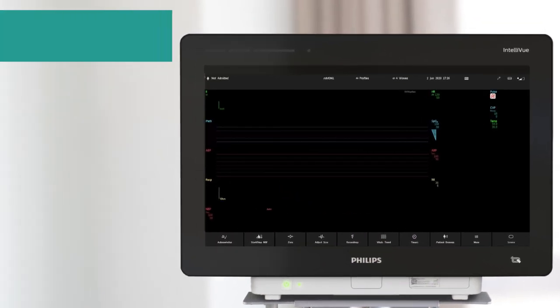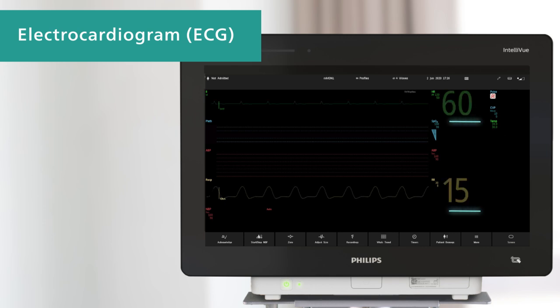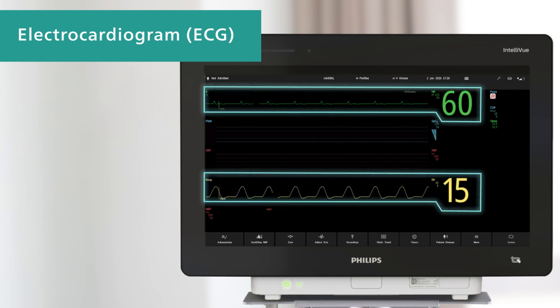Let's start with the electrocardiogram, or ECG, which measures the electrical activity of the heart and can also measure the respiratory rate. The monitor displays the ECG waveform, heart rate numeric, and other information from the ECG.